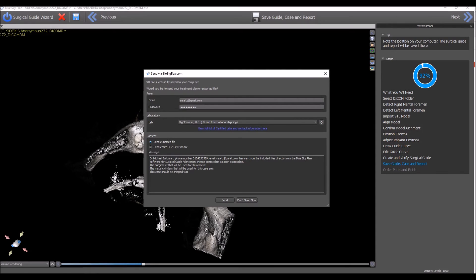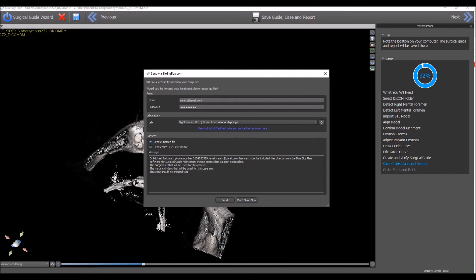In terms of what's being sent, you can choose either to send the exported surgical guide or you can choose to send the entire Blue Sky Plan file. Decide what you want to be sending and select the relevant radio button.